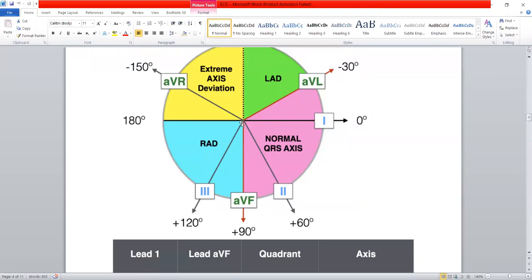If the current is flowing away from a lead, it will show a negative QRS on the ECG in that lead. So the QRS complex in lead one will be downward, and in lead AVF it will be upward. The QRS complex is downward in lead one, meaning the current is flowing away from lead one. It is positive in AVF, so the current is flowing towards AVF. The axis lies between +90 and 180 degrees, which is the right side of the heart — right axis deviation.